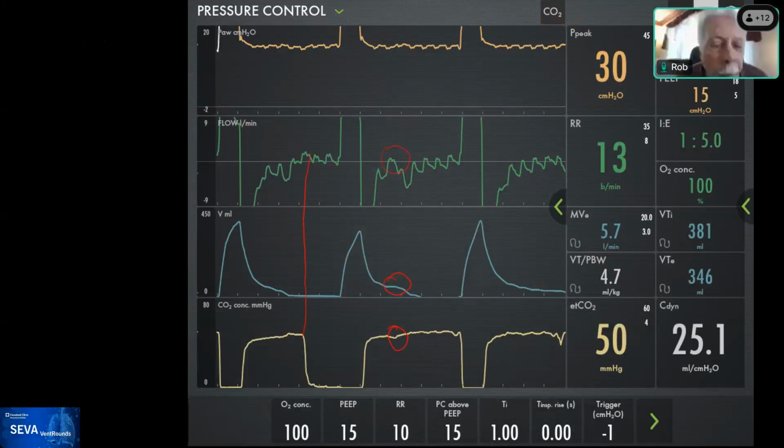And the rate's already pretty low, right? Yeah, well, I went down on the rate because I wanted to show the abnormalities and see if I would catch the patient. Right. I love the question from Zane. He says, if the end tidal is more sensitive, why can't we make it a trigger parameter?